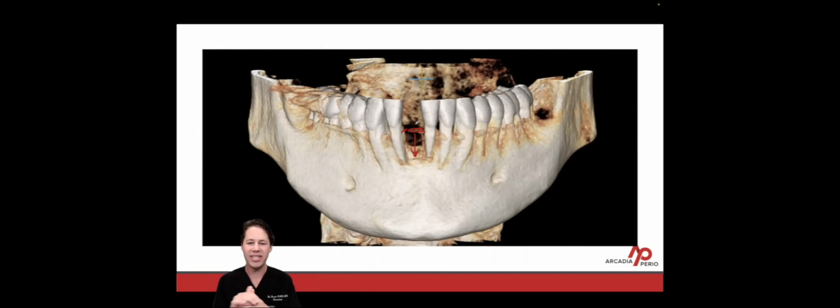Interesting case. But let's look at this now from a lingual aspect. Again, very challenging case in terms of the amount of bone that's missing both horizontally and vertically.